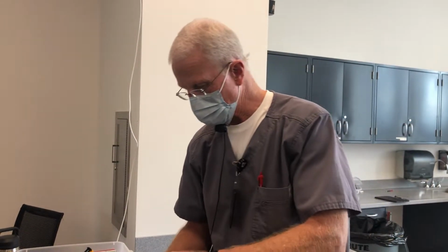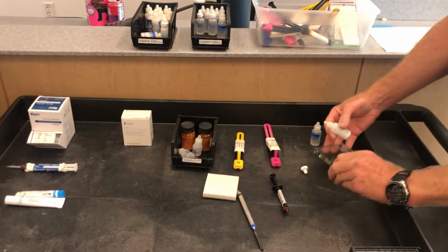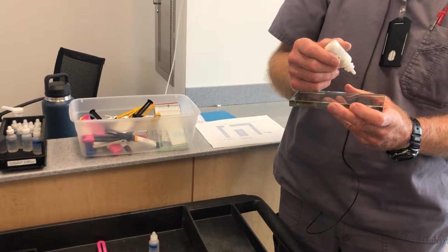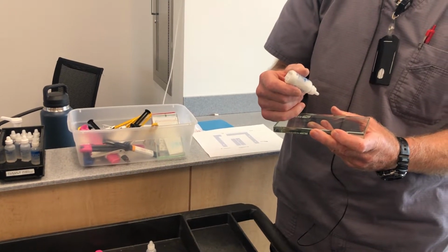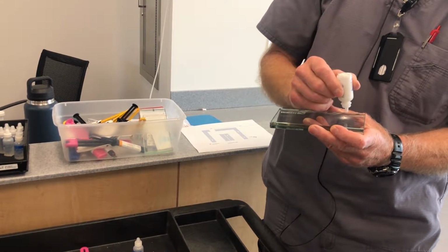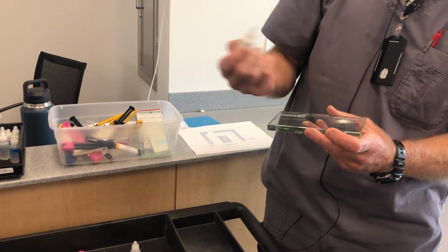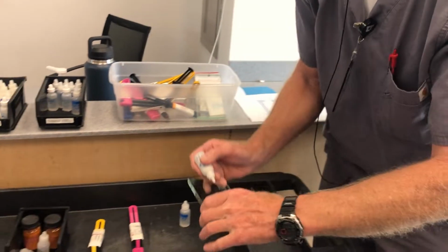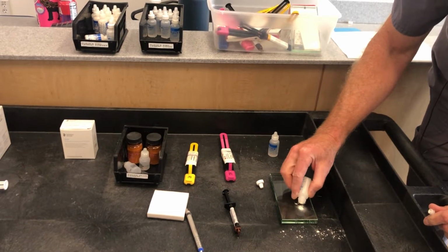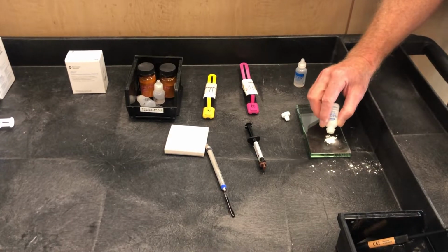You divide the powder, literally, and I can kind of show you with this. We're not going to mix any today. We could. If anybody wants to mix it, let me know. But you would take the powder, you always mix it on a chilled glass slab. So at least a glass slab and chilled if possible, because it slows the reaction down a little bit. And so you would add your powder. You'd measure it out.